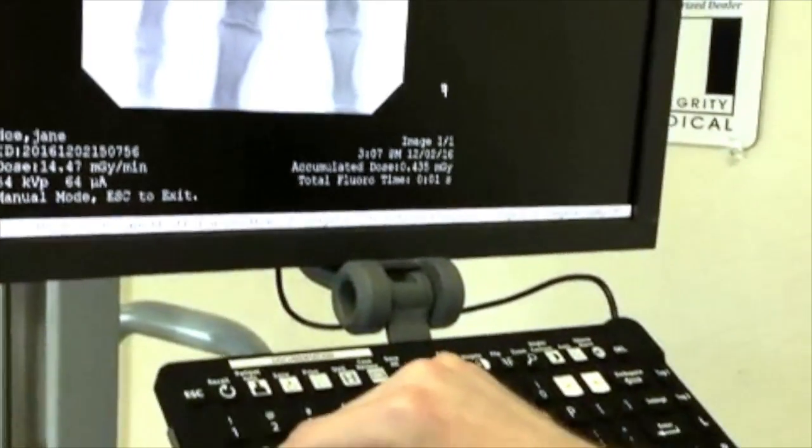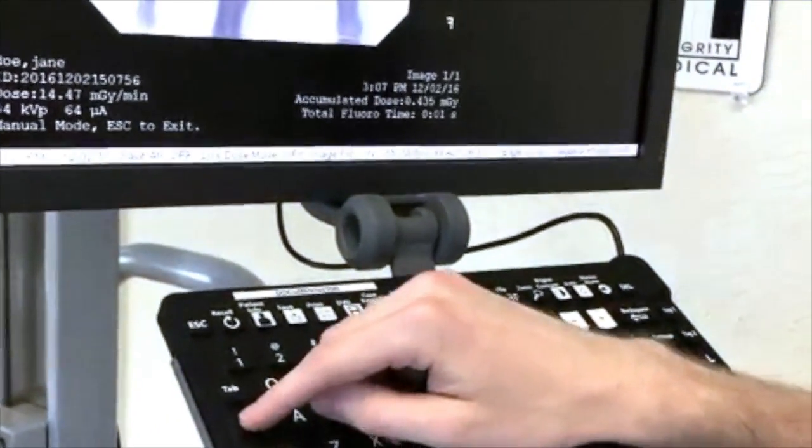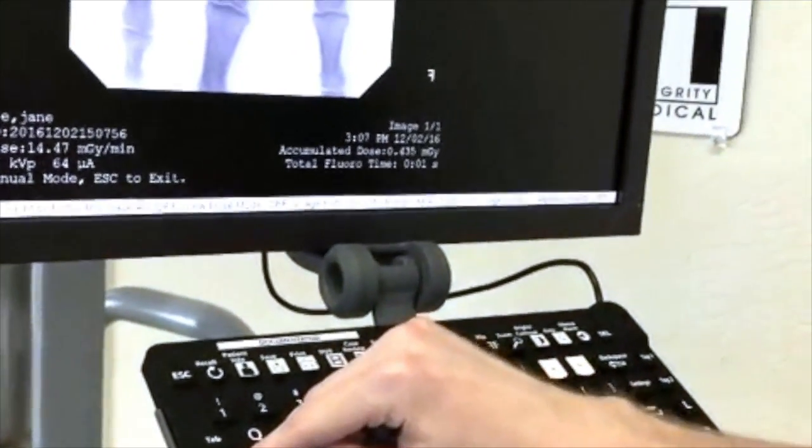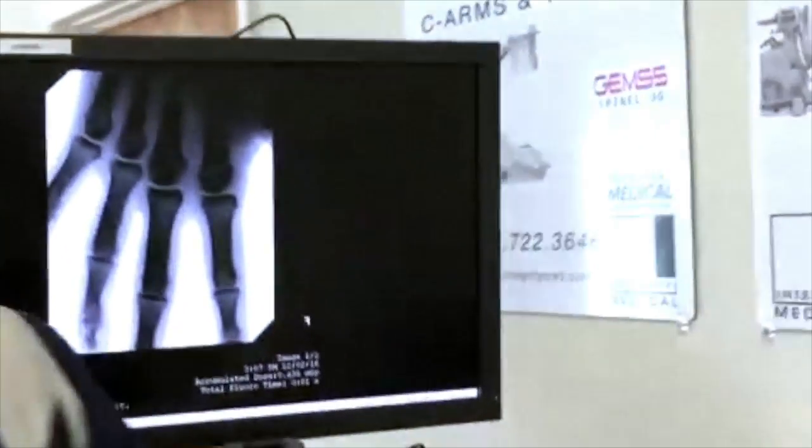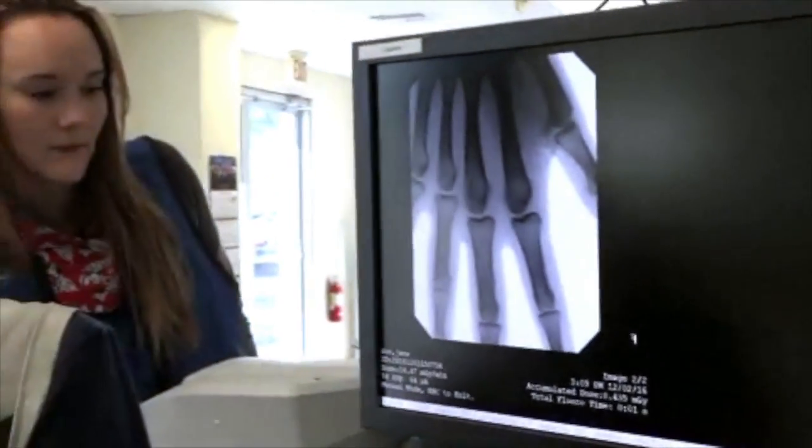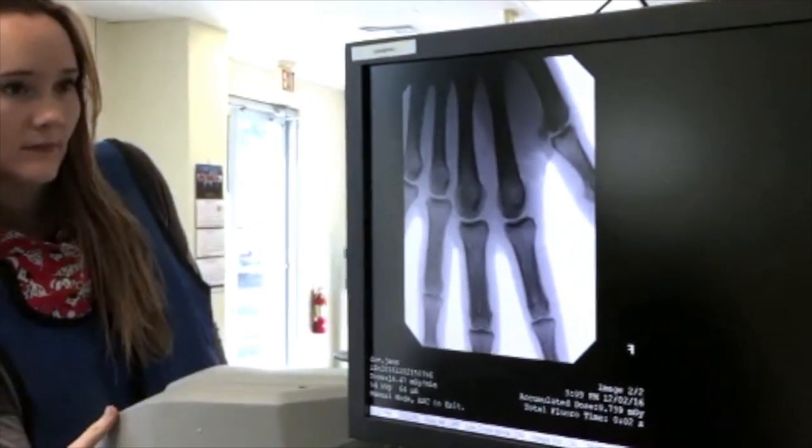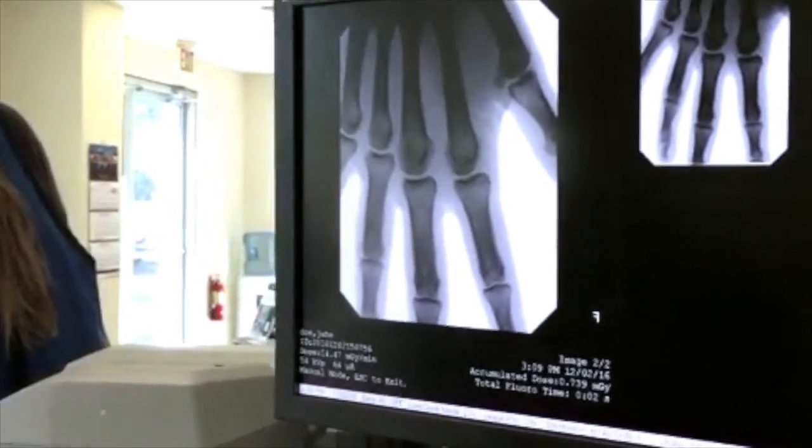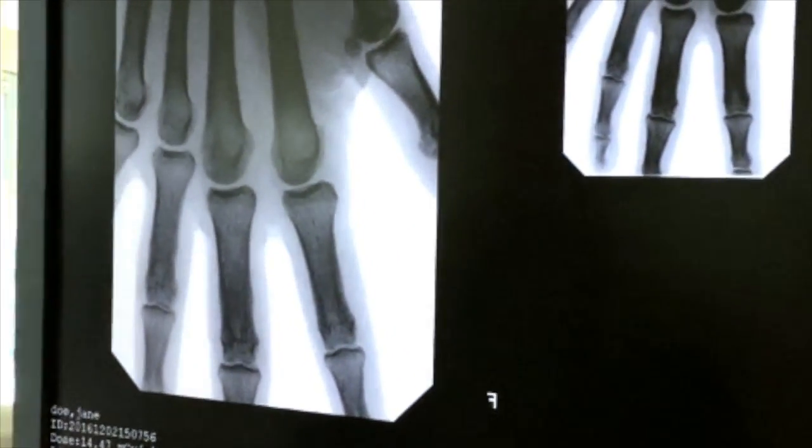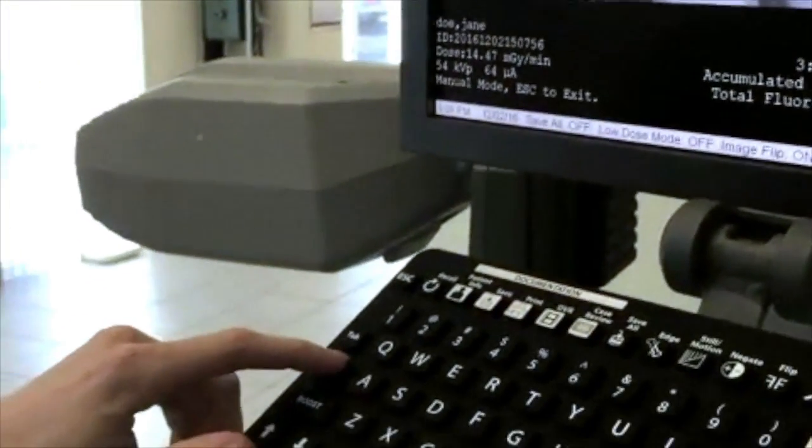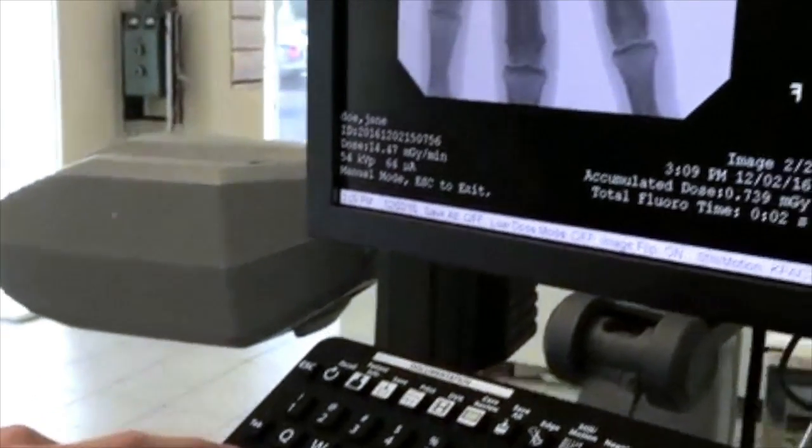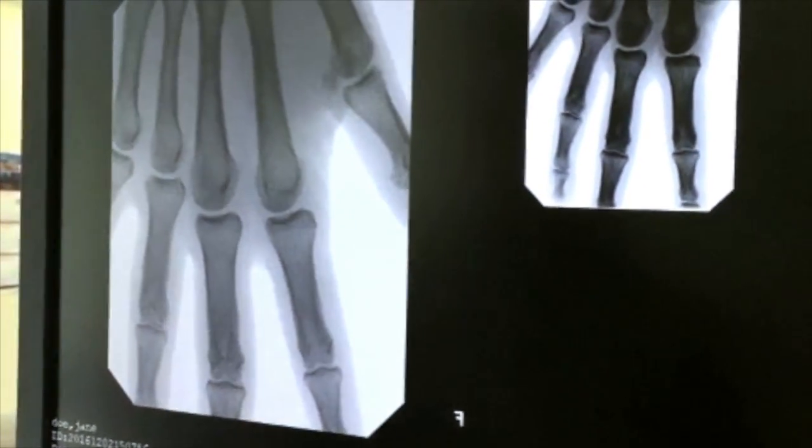So I shot it on high dose. Now we're going to shoot it on low dose. What you can also do, whether you shoot on low dose or high dose, is press the mode button and it will show you what the image looks like on the other dosage level.